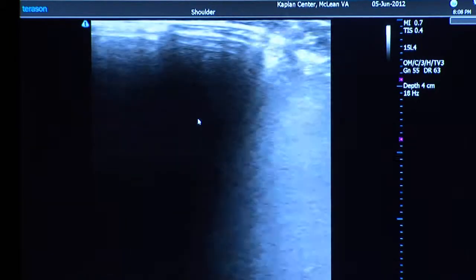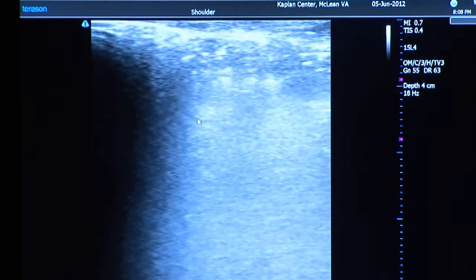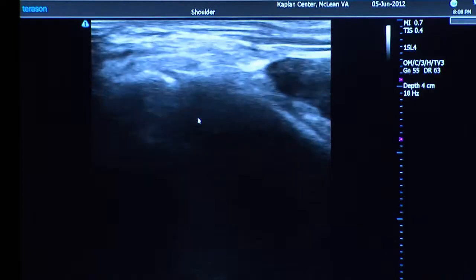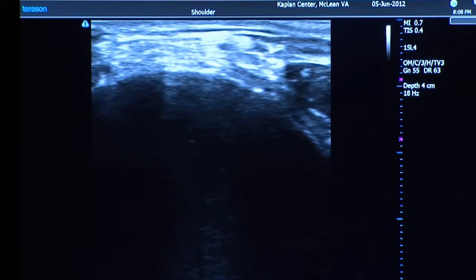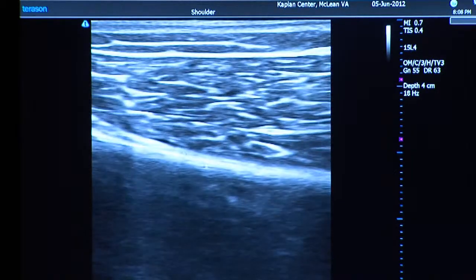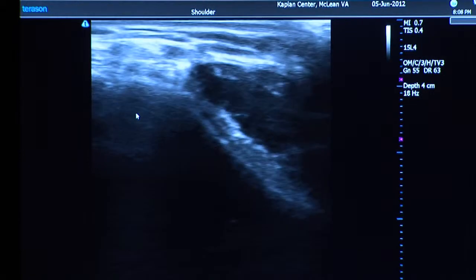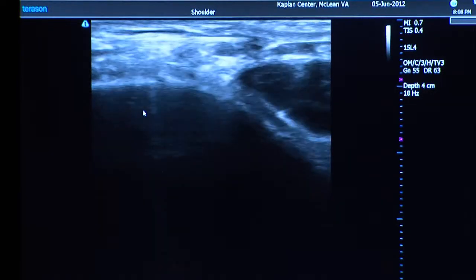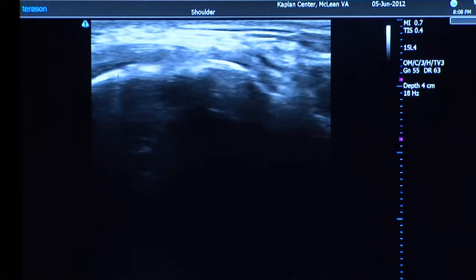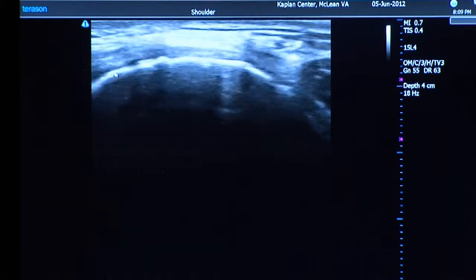Now I'm going to move to the inside edge of the knee. This right here is the inner part of the thigh bone — the femur — and I'm tracking down as it gets thicker. Right there is sort of the most inner part; when you push on your knee you can feel that little bony part on the inside edge — that's what this is right here.